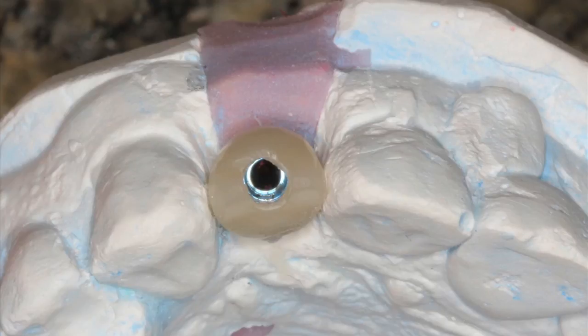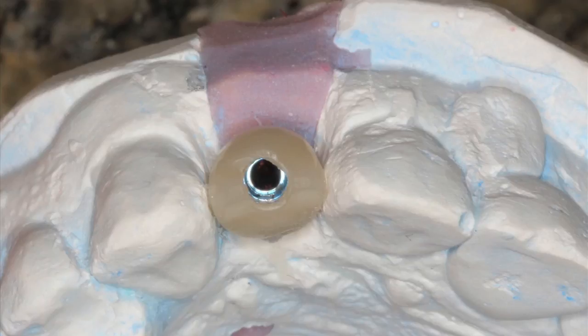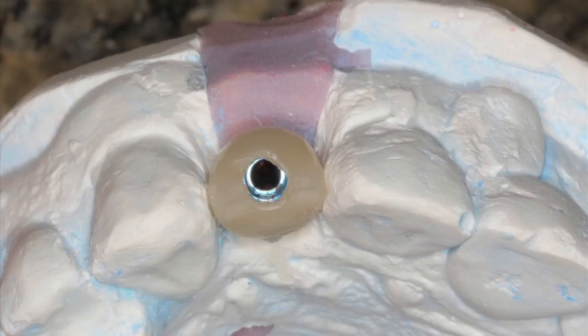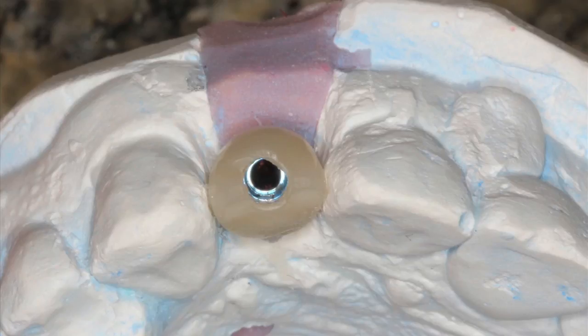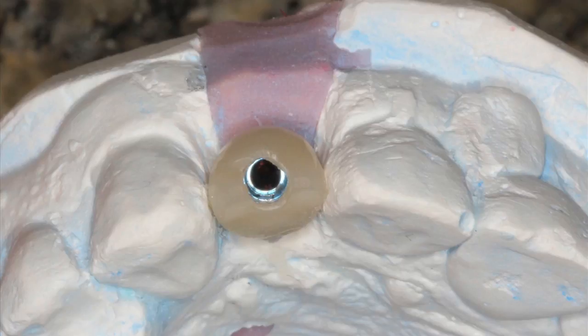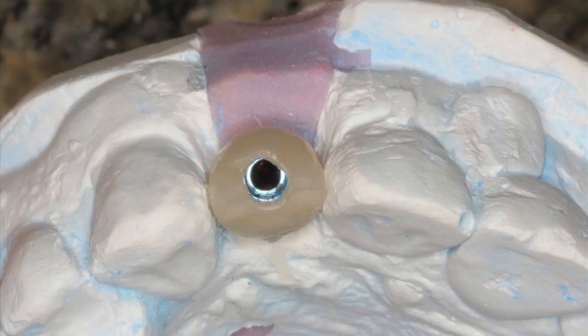Here's our restoration milled out. In this case we used a Paradigm composite block from 3M. It is milled out, the screw hole is completed, so we have access to make this a screw-retained temporary restoration.